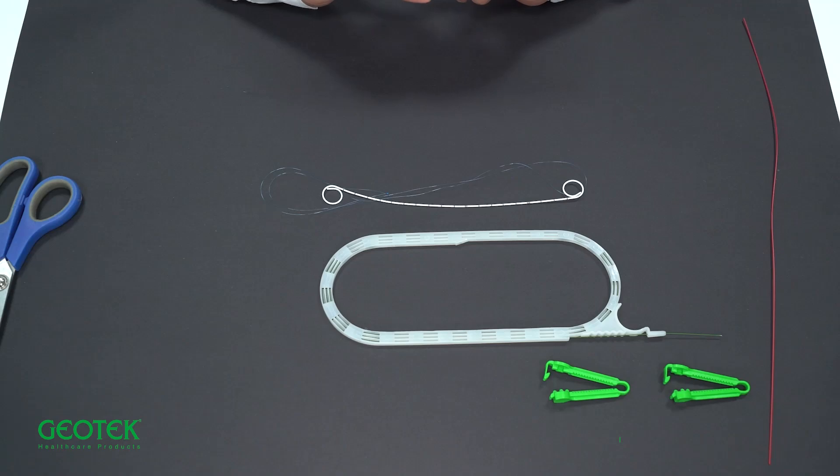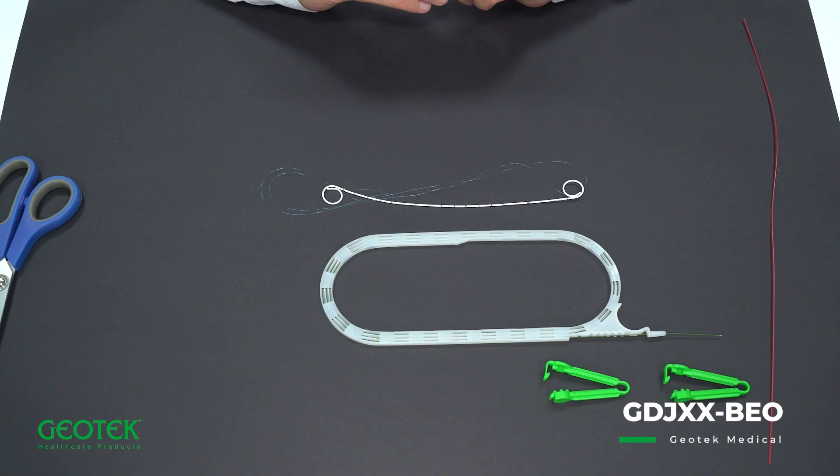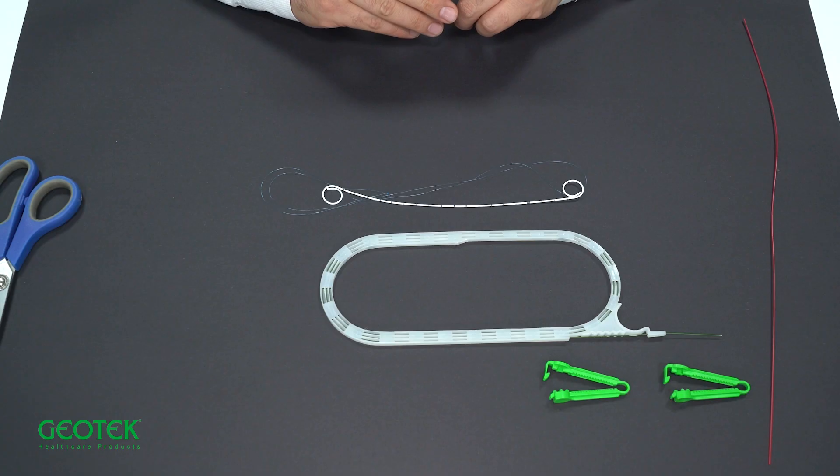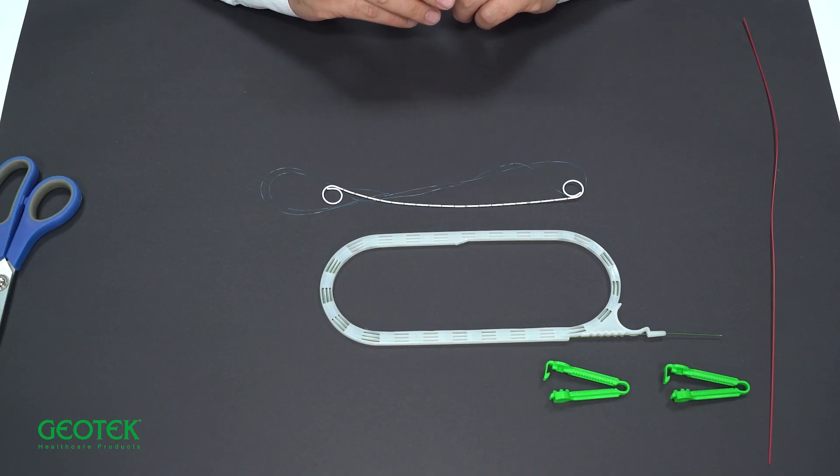This product is a double J ureteral stent. Double J ureteral stents are used to pass ureteral obstructions and to relieve the renal collecting system. They can be used routinely or as a setter after endoscopic ureteroscopy and endoscopic ureteral stone surgery, as well as in the passage of stenosis due to tumors or compression from outside the ureter or fibrosis.